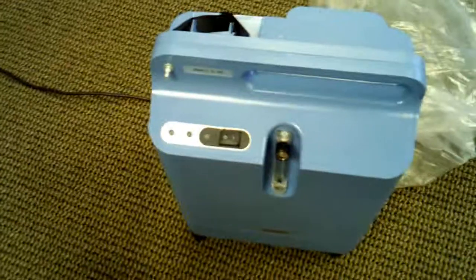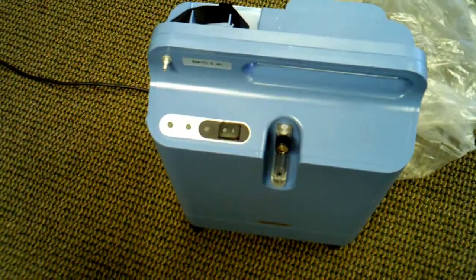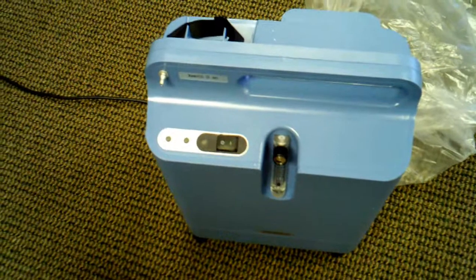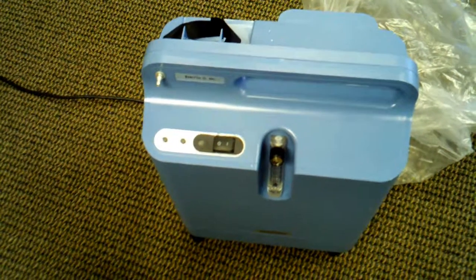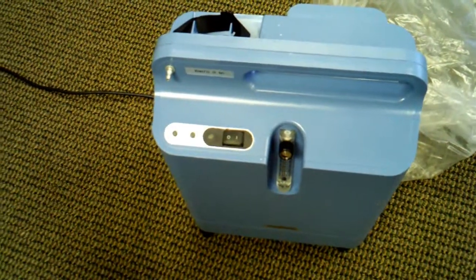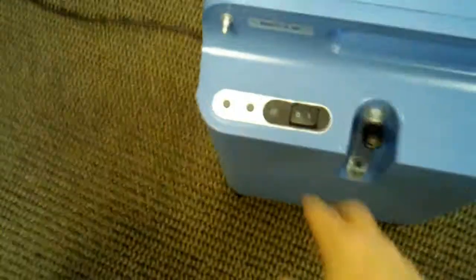We've seen these concentrators change a lot over the years. The older model was the Millennium, which was about 10 to 15 pounds heavier than this one, along with the fact that it was much bigger. I'm going to go ahead and turn this one on so you can see it running.